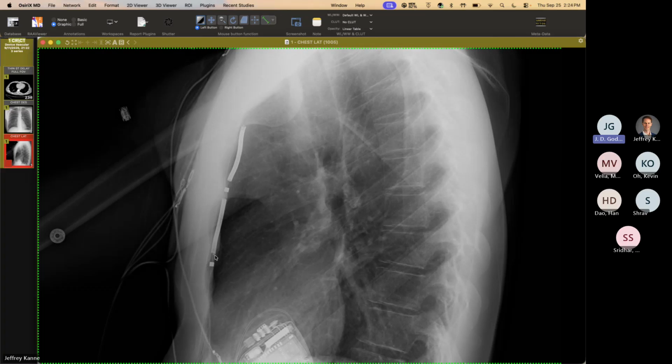So, Jeff, we've had a similar phenomenon. It was reported a few years ago. Calcified fibrin sheaths around catheters that are extracted. When you pull out the catheter, sometimes the little sleeve of gunk that is organized around it, which may have calcifications in it, is stripped off, and you actually can see sort of a tubular arrangement of the calcium. And I think there were some tubular-looking sections when you were showing the CT.